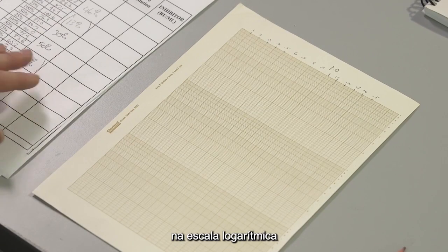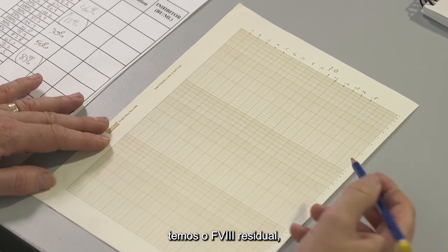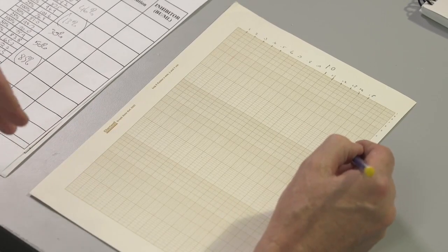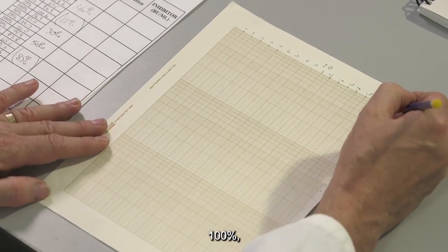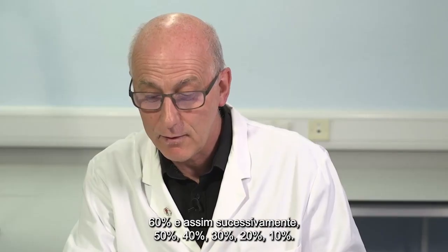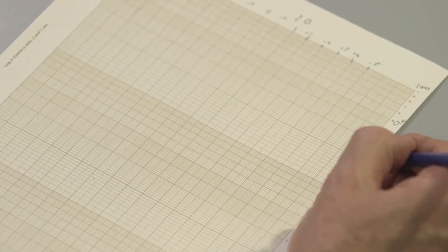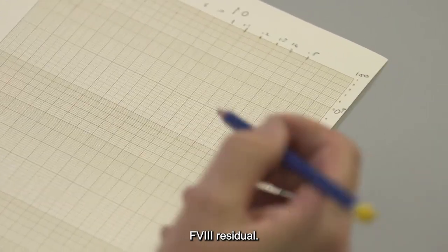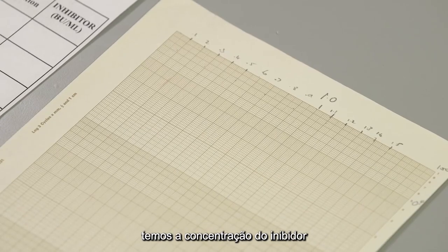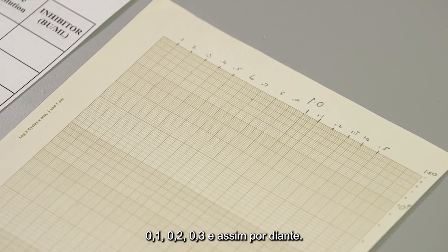On the logarithmic scale, on the vertical axis, we have the residual factor 8. 100%, 90, 80, 70, 60 and so on. 50%, 40, 30, 20, 10. And then on the x-axis, we have the inhibitor concentration. 0.1, 0.2, 0.3 and so on.